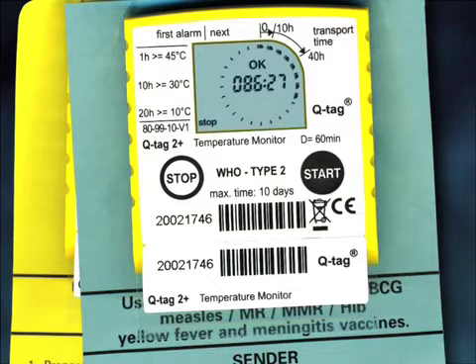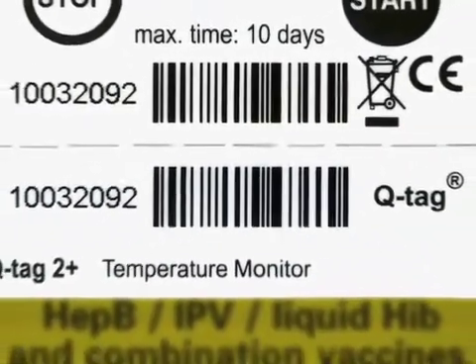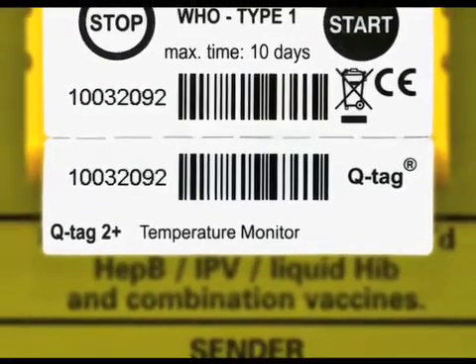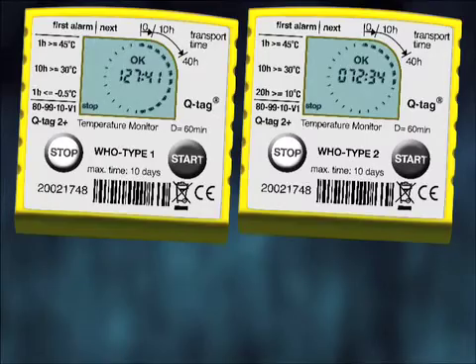The Type 2 device is attached to a blue backing card and is designed to accompany the OPV and freeze-dried BCG, measles, MR, MMR, lyophilized Hib, yellow fever, and meningitis vaccines. Each device has a unique barcode. A twin label of this unique barcode sticker should come from the vaccine manufacturer along with a list indicating which device has been put into which box.